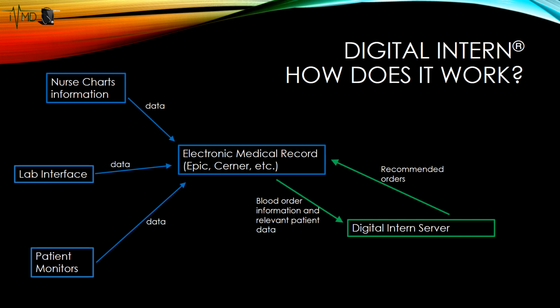The medical record system will continue to collect data about patients from existing sources, which might include human data entry, interfaces with monitoring devices, and interfaces with the lab. The Digital Intern will reside on its own server behind the hospital's firewall. It will communicate via interface with the medical record system.